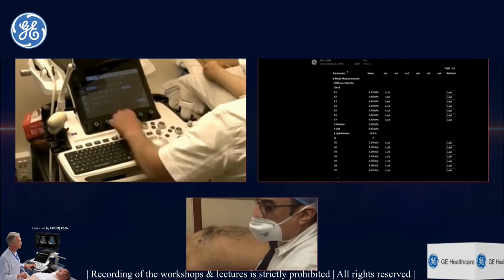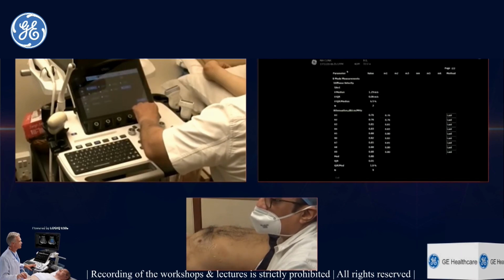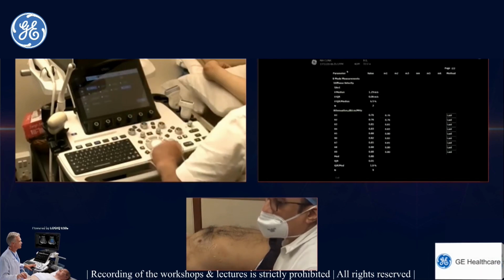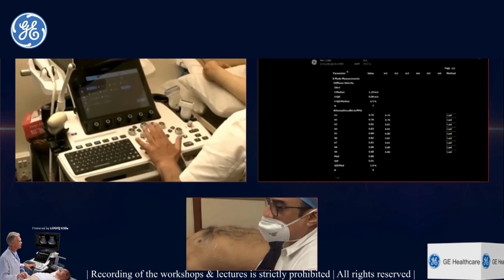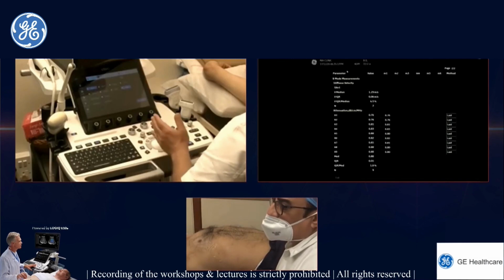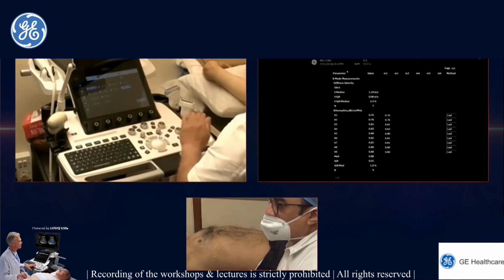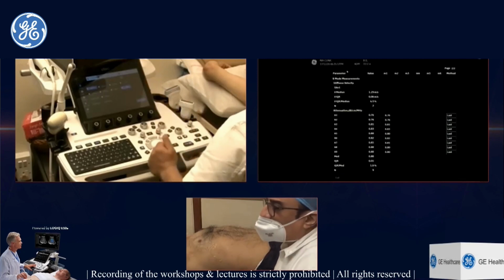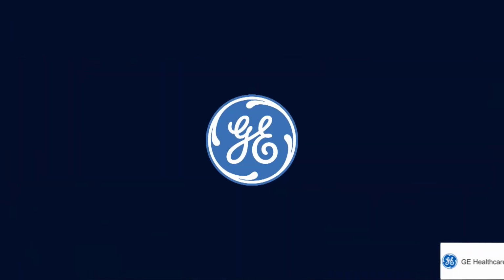So we have an IQR of 4.5% with a median of 1.29 meters per second. So there's no liver damage, there is no fibrosis, but there is excessive fat accumulation. So we are at the NAFLD stage where S3 steatosis can convert to fibrosis if we don't control our fat content.